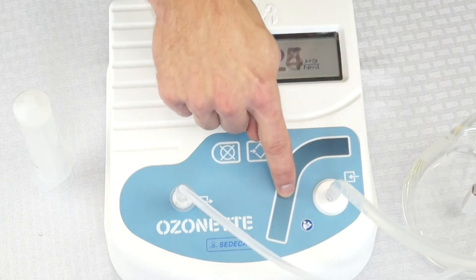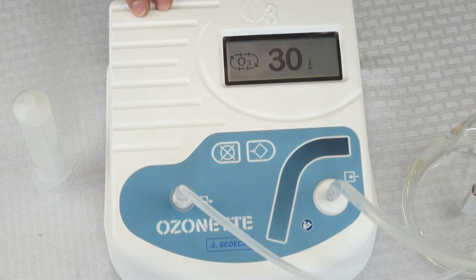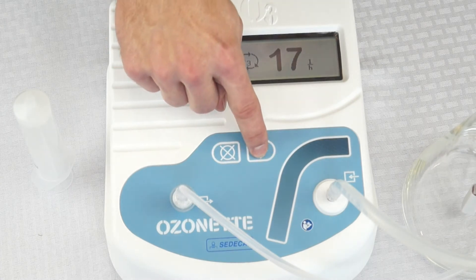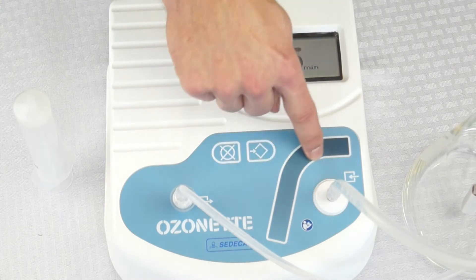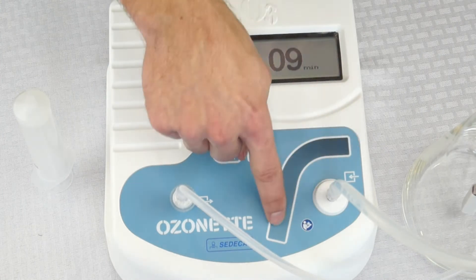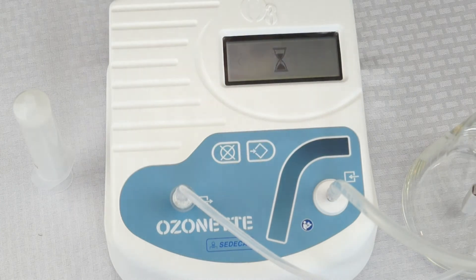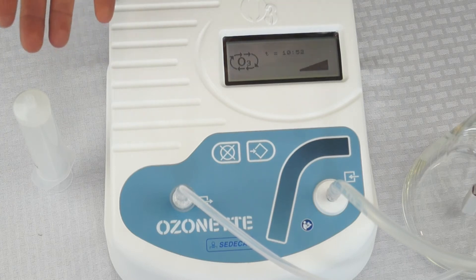Select your concentration and hit enter. Then set the flow rate in liters per hour, hit enter, and select how long you want to ozonate for. Hit enter and the generator will automatically produce ozone for the specified amount of time.